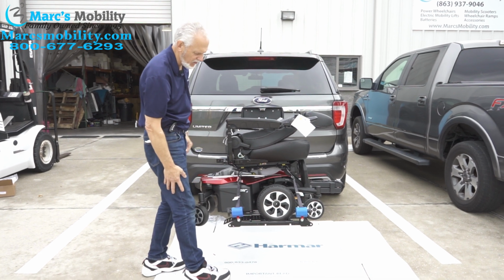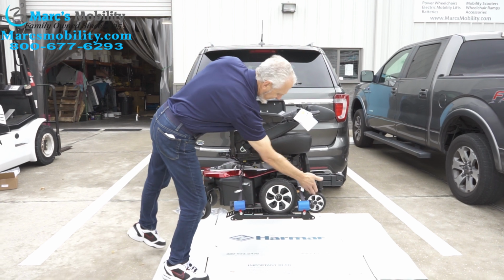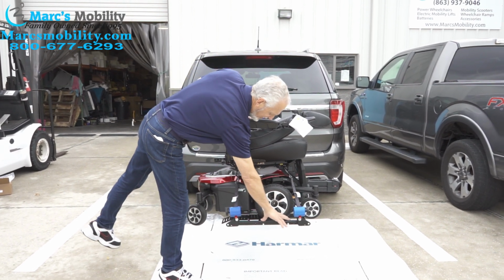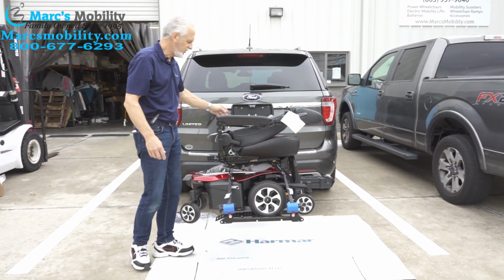You definitely need a cover, but as you can see, with a smaller chair, with the smaller wheels, you do have to have 6 wheels. 1 in the front, 1 in the back, and the drive wheels in the middle. And you have to have these as close as possible for these smaller chairs, and that would work. So I'm going to take the chair off.